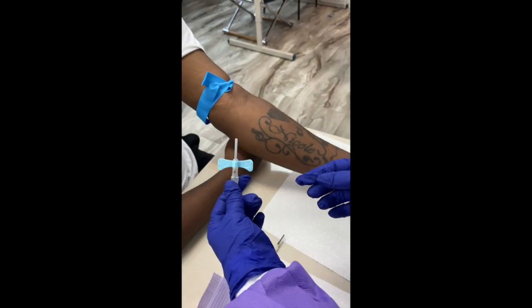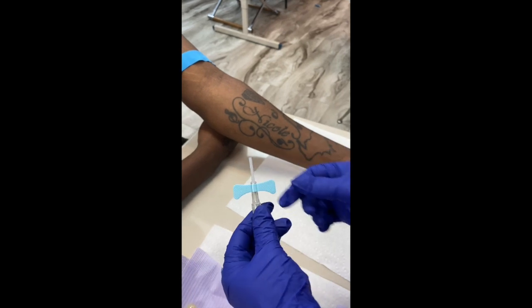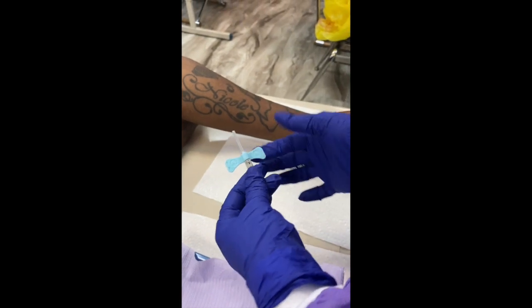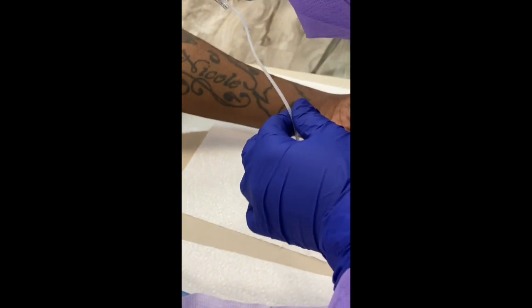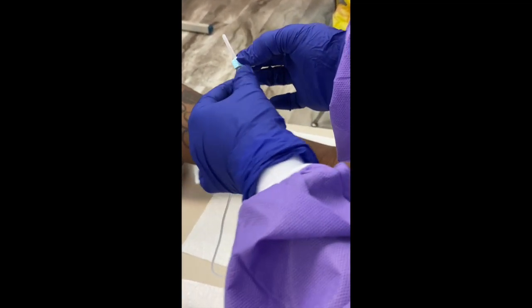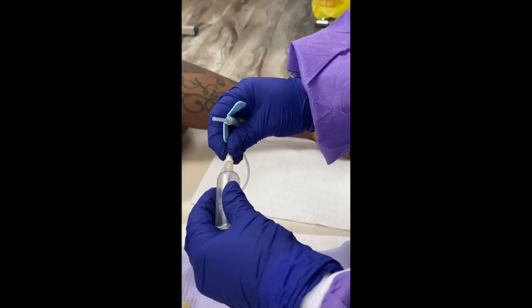It has wings, like a butterfly. I want to take off that tourniquet because you don't want it on longer than one minute. The wings are like little wings, and there are grippers — little bitty nodules — and that's how you want to hold the butterfly. You want to hold it where you're gripping the nodules. There's a nice long string there, and a lot of times it's not good to have a butterfly for a PT/INR or a sodium citrate tube because of all the air.